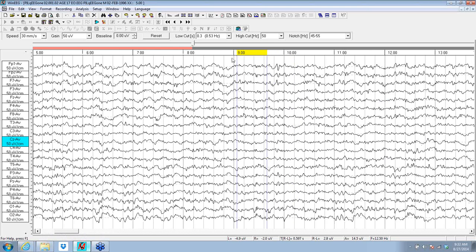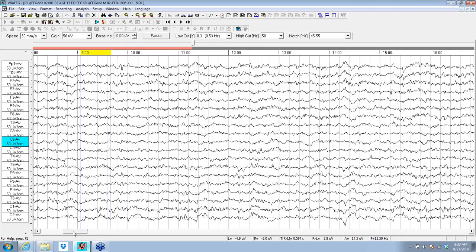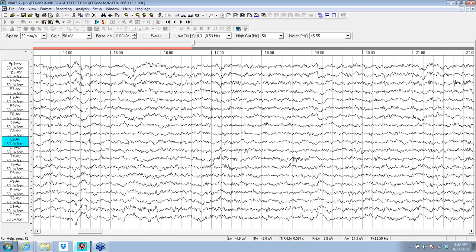Now, there was a slow wave that was here. What's the slow wave? Well, that temporal source here was, in fact, the source of an ear reference contamination that contaminated the entire EEG. So we're away from the ear references, and the EEG here has some slow content at the vertex intermixed with faster activity.